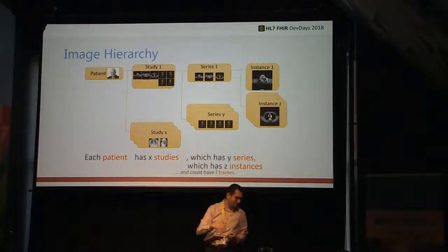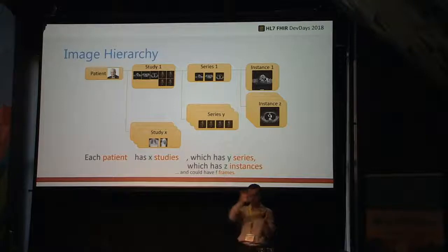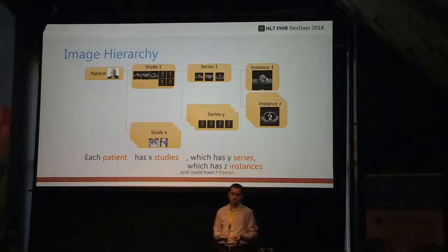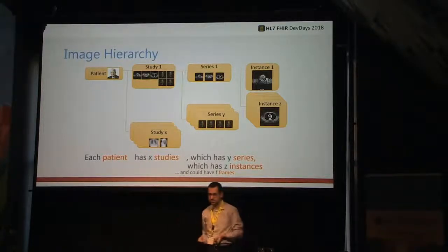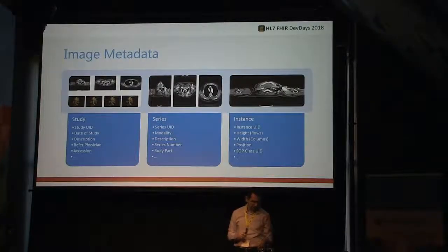Anyway, so for example, with an X-ray, it's a single image usually, or like a few, but you're looking at them one at a time. With a CT, they're usually stacked, so you play them pretty much like movie style, but they're actually individual images. So that's the reason why you could have multiple instances in a series.